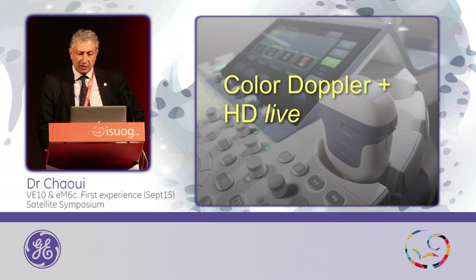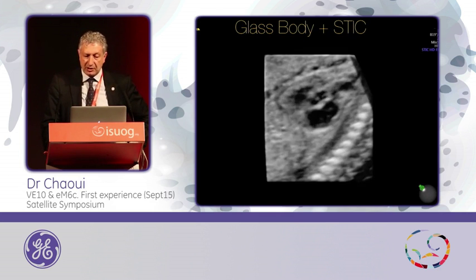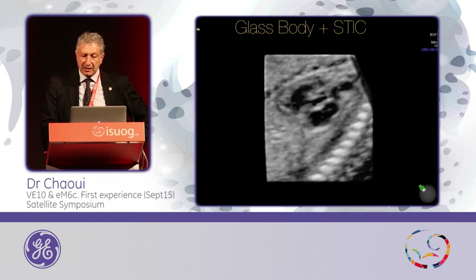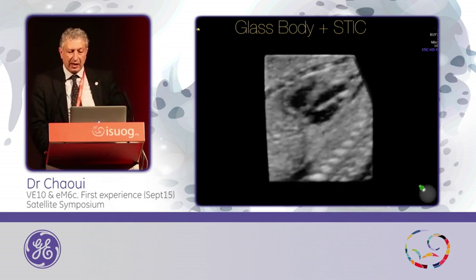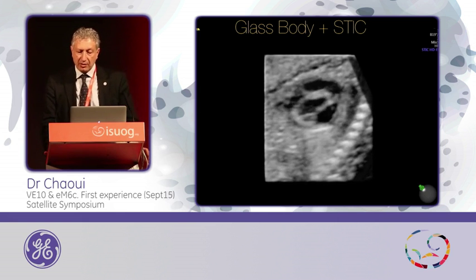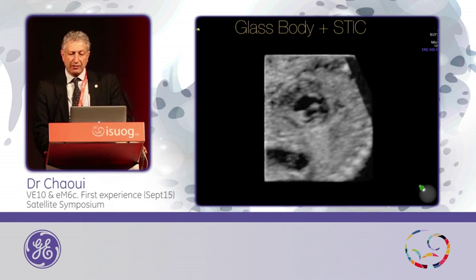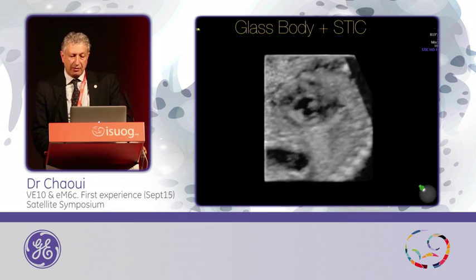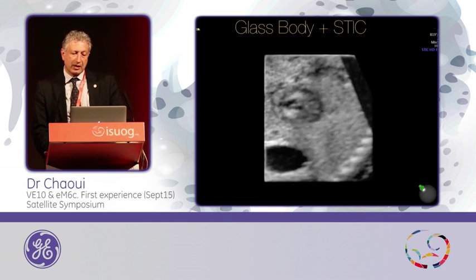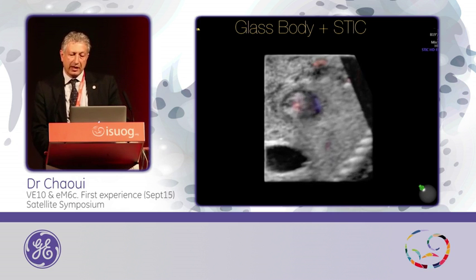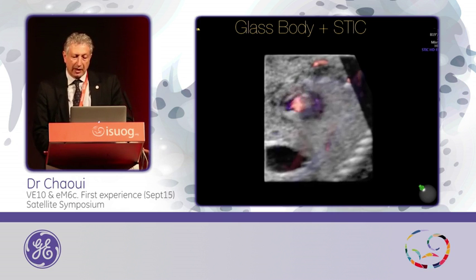My favorite, of course, is going to be, at the end, color Doppler with HDLive. This is an example of an acquisition with the glass body mode using the STIC. I decided to look at only the grayscale information, and moving from right to left, you see the mitral valve with the fish mouth sign, and then you see the stomach, and then you can scroll back to the right side — and then you can add the color Doppler.